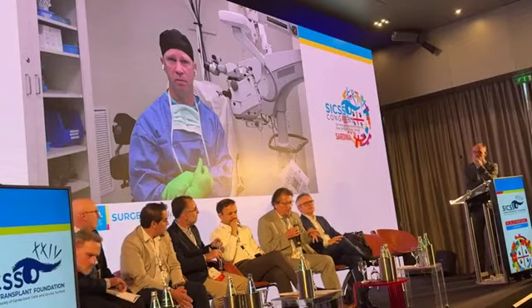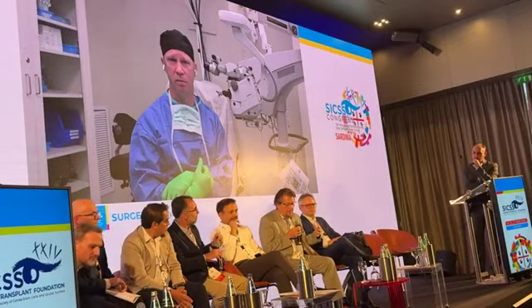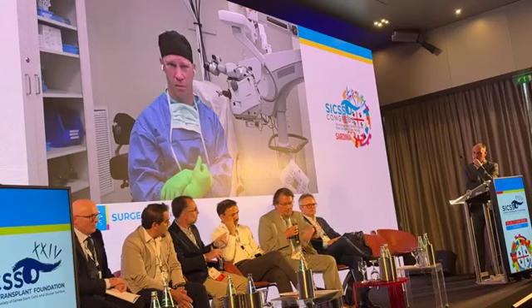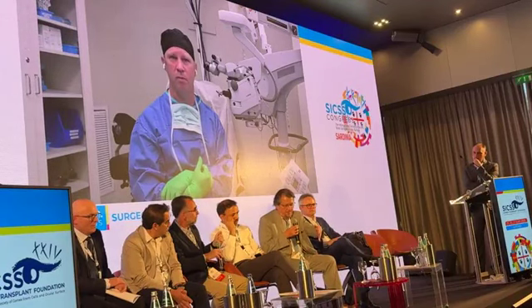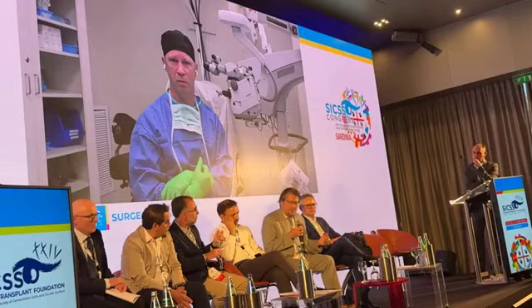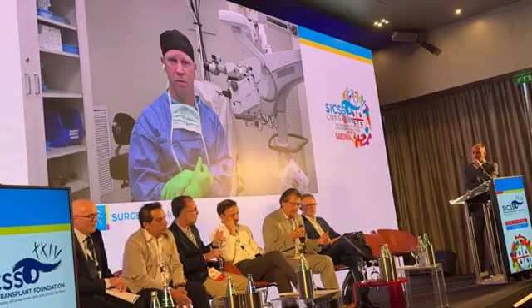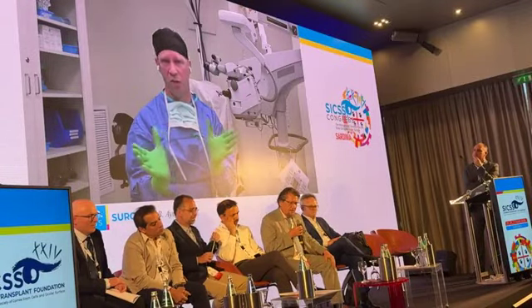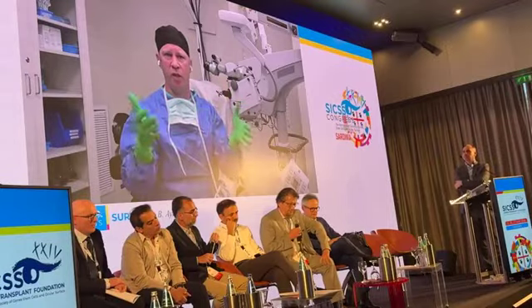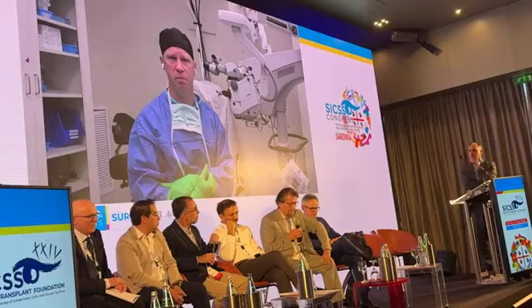keratoplasty. But this particular patient had the implant in the lower part of the cornea, the central part of this ring was so this was the positive or the negative axis of the astigmatism. So it was basically in the positive axis of the astigmatism. He was with 180. And we're basically trying to pick up that cone to regularize the corneal shape.